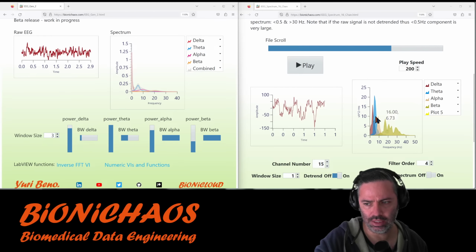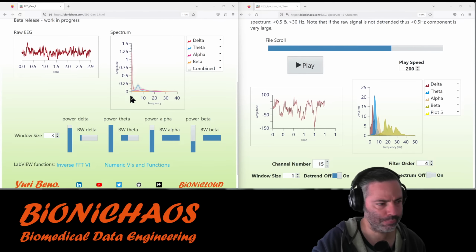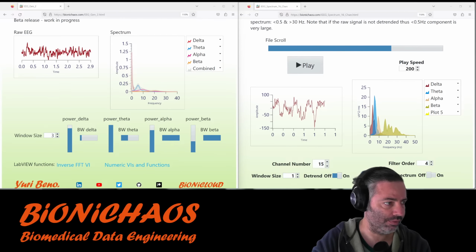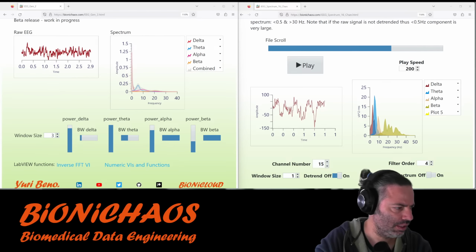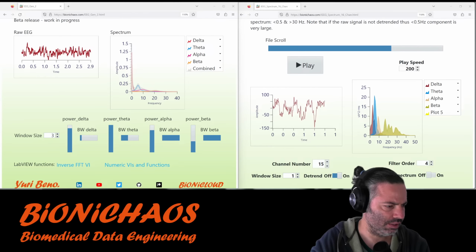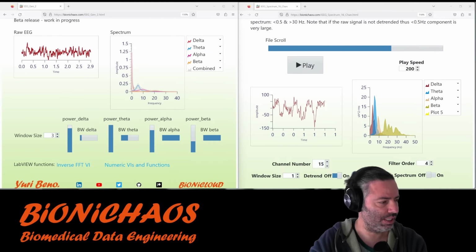So I could translate this energy, the power, into a slider up and down, and then create the synthetic EEG out of it. And yes, probably EEGLAB and things like that will have better resources. There's also another, so I actually want to try this next. There's another similar EEG data generator publication from 2018, University of Oxford. But then they're using EEGLAB, so that's actually not a publication.